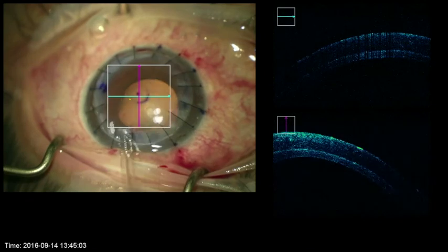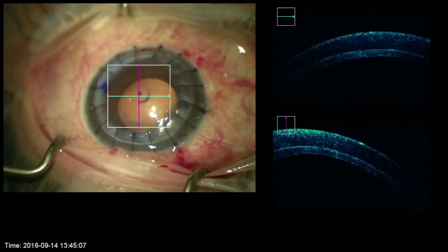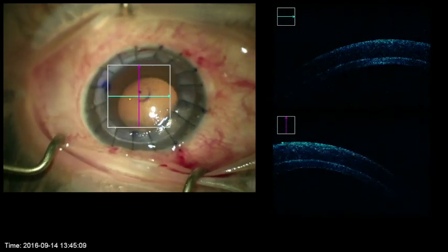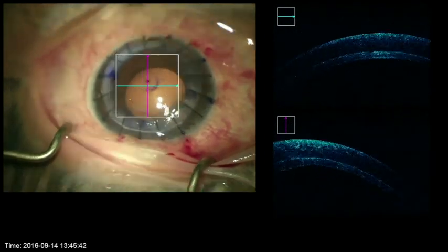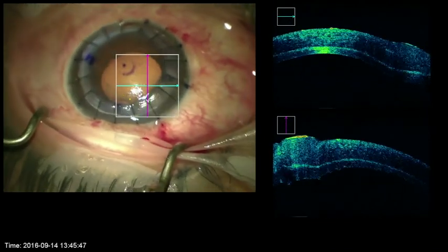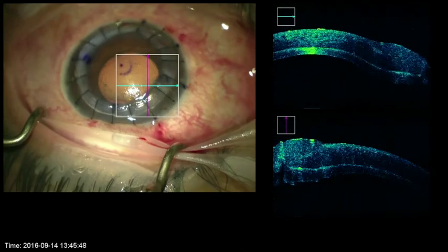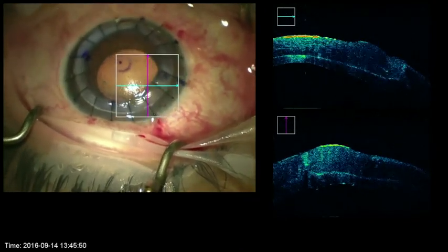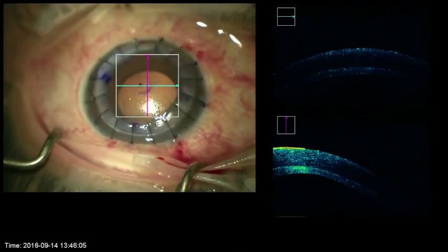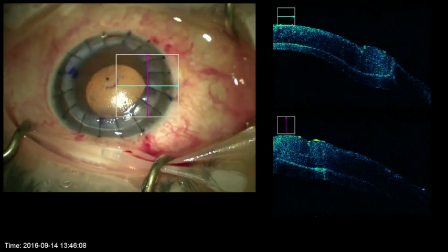Once suturing is completed, the OCT confirms good apposition without wrinkles. As seen in this frozen image at the edge of the wound, the OCT shows the donor cap tucked under the recipient edge. This tuck position is also visible here.